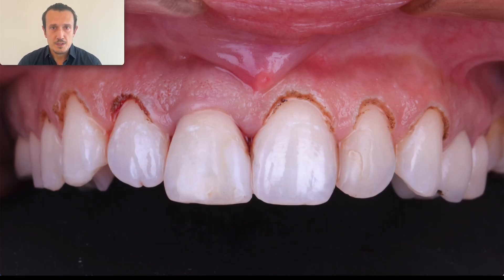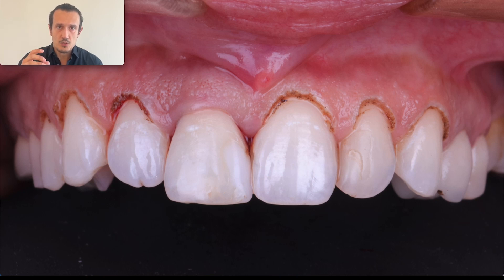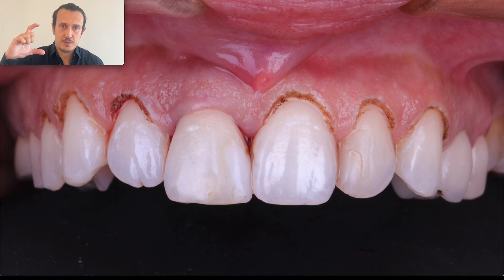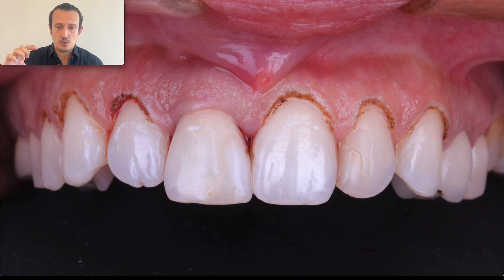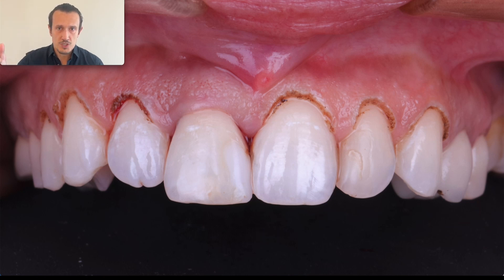Then we need to perform the crown lengthening, which consists of two parts: the soft tissue part and the bone part. I start with the soft tissue part before I position the implant because I need a reference for the depth of the implant — we need to put the implant at a depth related to the crowns of the natural teeth. So first I expose the crowns using the electrosurgical device.